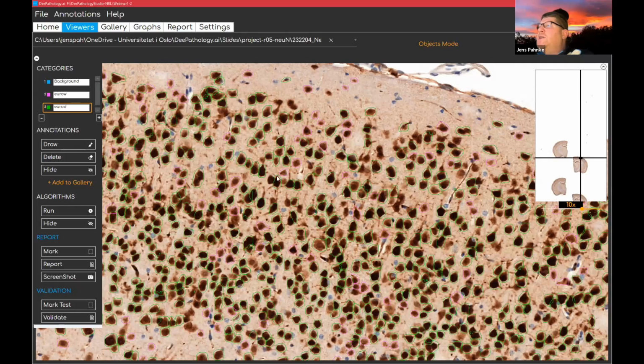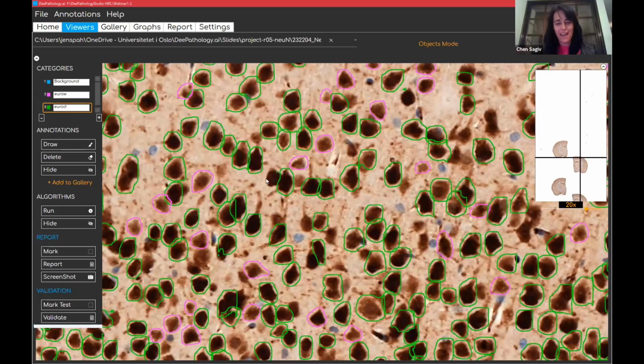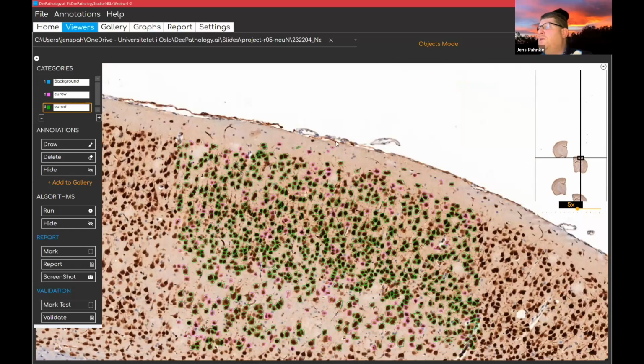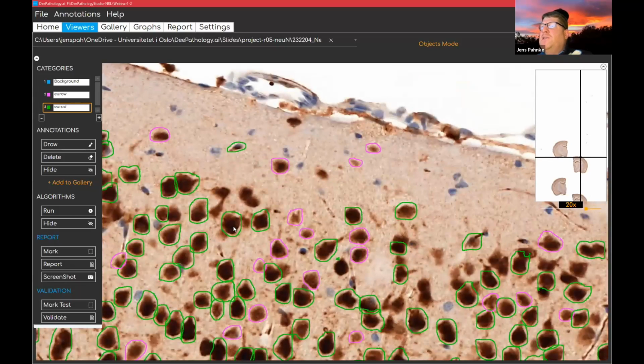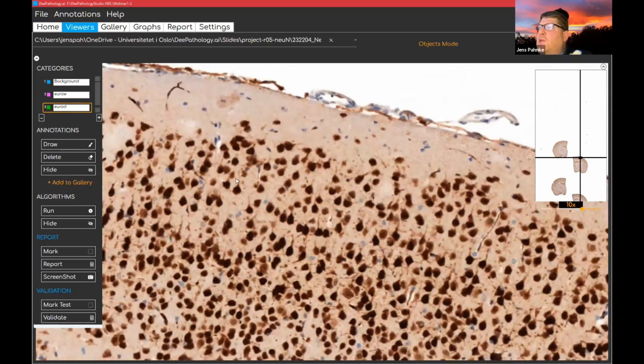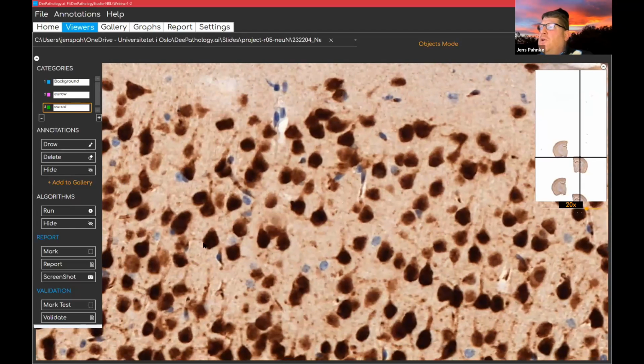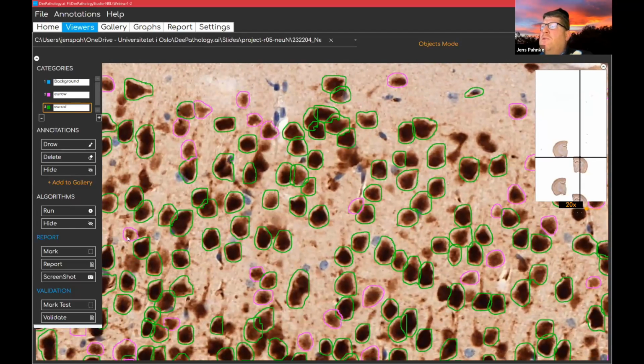So precisely. So now we can go in. Like you said, everything appeared at once. In this mode for the algorithm, everything appears at once, and it appears actually all that was in my field of vision. So let's have a look. How exact is this? So these are the dark ones. It looks good. These are the more brighter ones. It also looks good. It works actually very nice. You see darker ones, brighter ones. So here are darker ones. Here's a brighter one that is violet here as well.